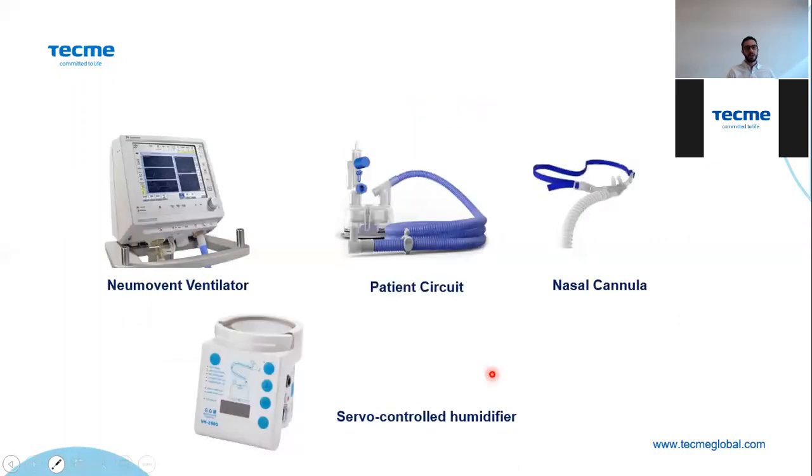And of course, you will need a different patient circuit here. You will need the ventilator, and also a servo control humidifier, a patient circuit with only the inspiratory limb, and a nasal cannula.